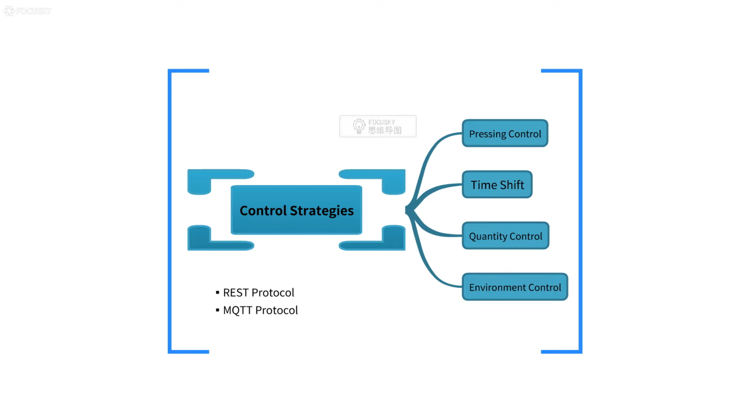Time shift provides information about what medicines the user needs to take at current time, and it will send a notification email if the user forgot taking the medicines. It publishes medicine data with JSON format. The key of the data is the username, and the value of the data is a list containing the medicine that the user needs to take. These information are used by quantity control. If the user does not need to take any medicines at this time, the medicine list will be empty.